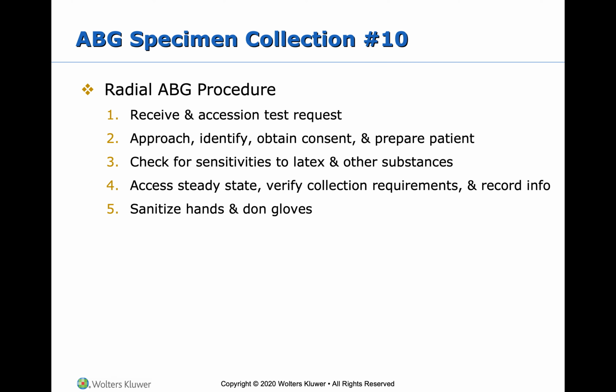Ask them if they have any allergies to latex or any other substances. We don't use latex. I don't think many facilities use latex anymore, so that's not as big of a concern. But if they're allergic to, say, the tape that you're going to use to tape the site, you're going to want to make sure that you know. Assess their steady state, verify any collection requirements, and record the information down.